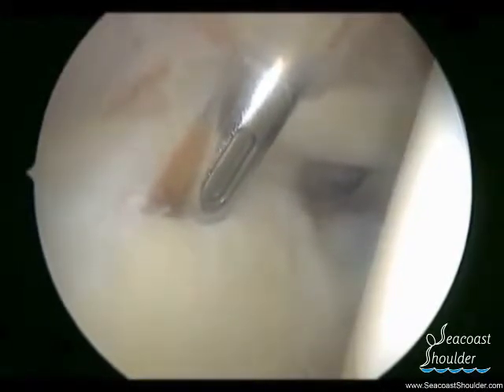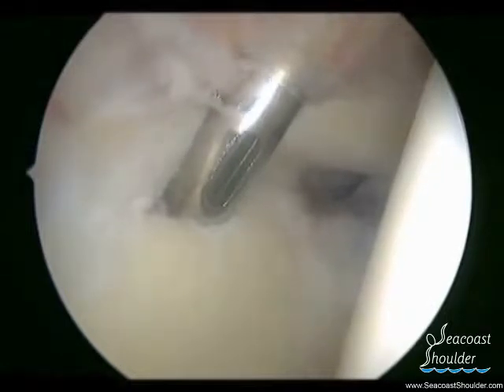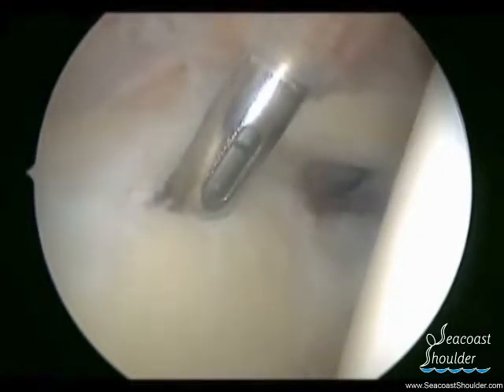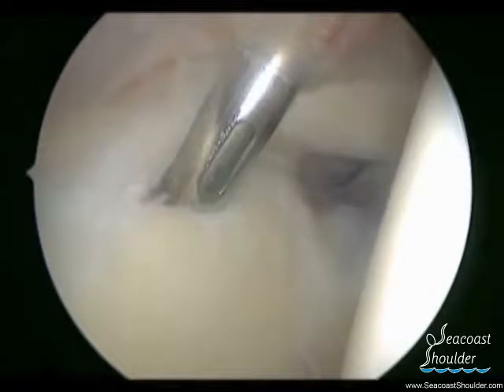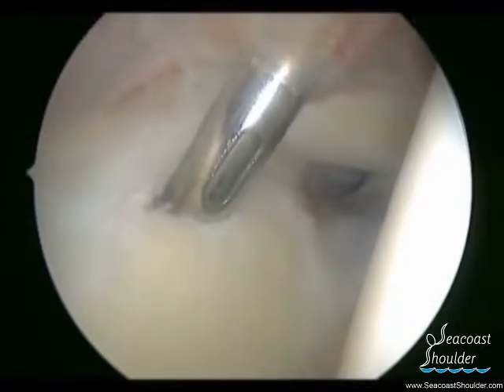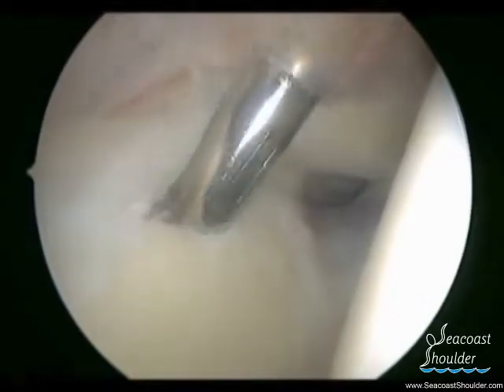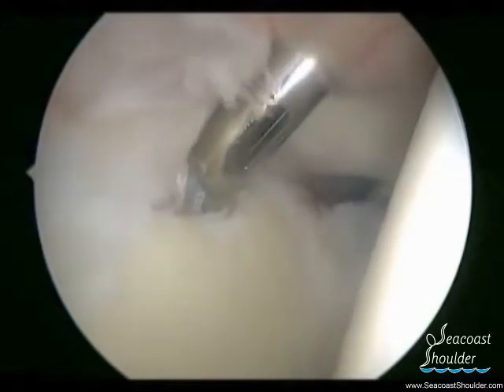We are now preparing the glenoid for an anchor which is being inserted. This anchor is like a harpoon — it will stick into the bone, and coming out of the anchor will be sutures that we can then pass through the labrum. Once the inserter and guide have been removed, we will be able to see the suture material as well as the labrum that is detached off the bone.